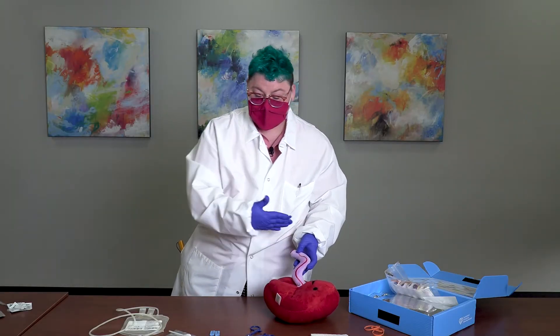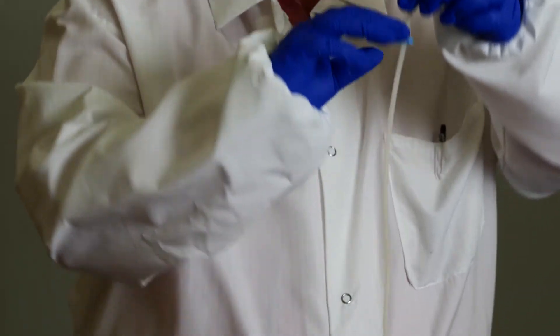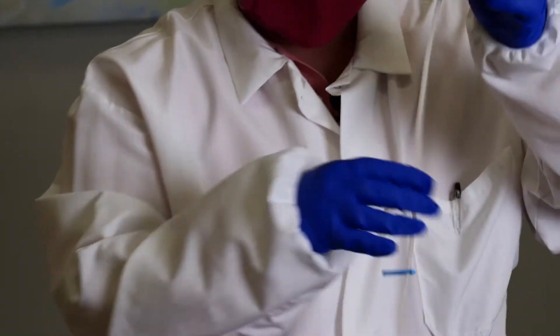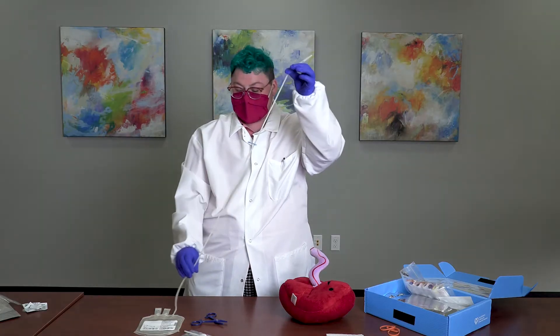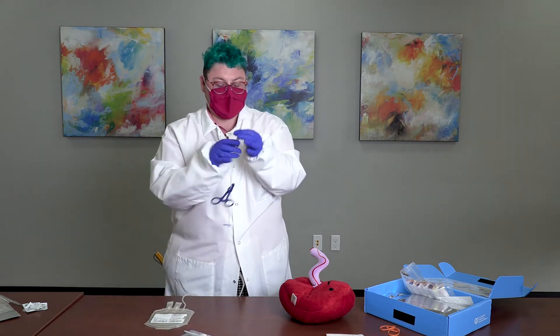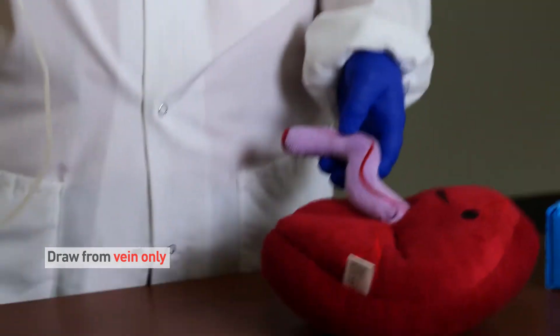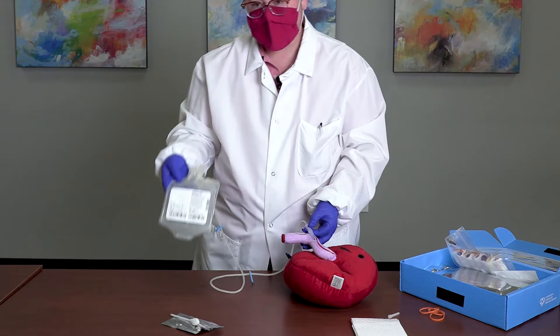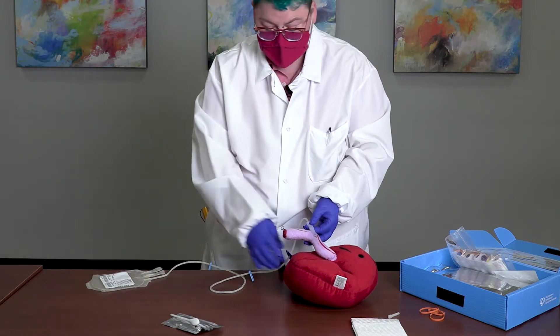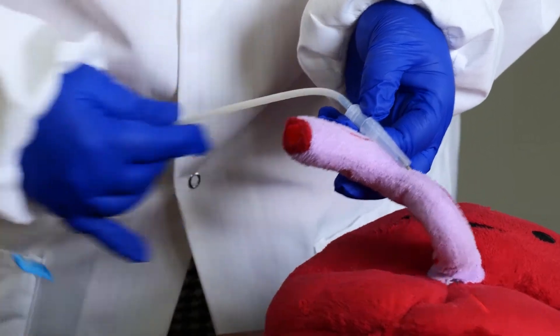Once the umbilical cord has been cleaned and dried, get the collection bag ready. Attach two blue clamps onto the collection bag tubing line — these should be loose and easy to move, not restricting flow. Next, use a hemostat and clip it behind the needle. When the hemostat is closed, it will prevent air contamination from getting into the collection bag after the needle guard is removed. When ready to start the collection, remove the needle cap. Insert the needle bevel-down into the vein. The collection bag should be slightly lower than the umbilical cord to aid blood flow. Once the hemostat is released, blood will flow into the collection bag.